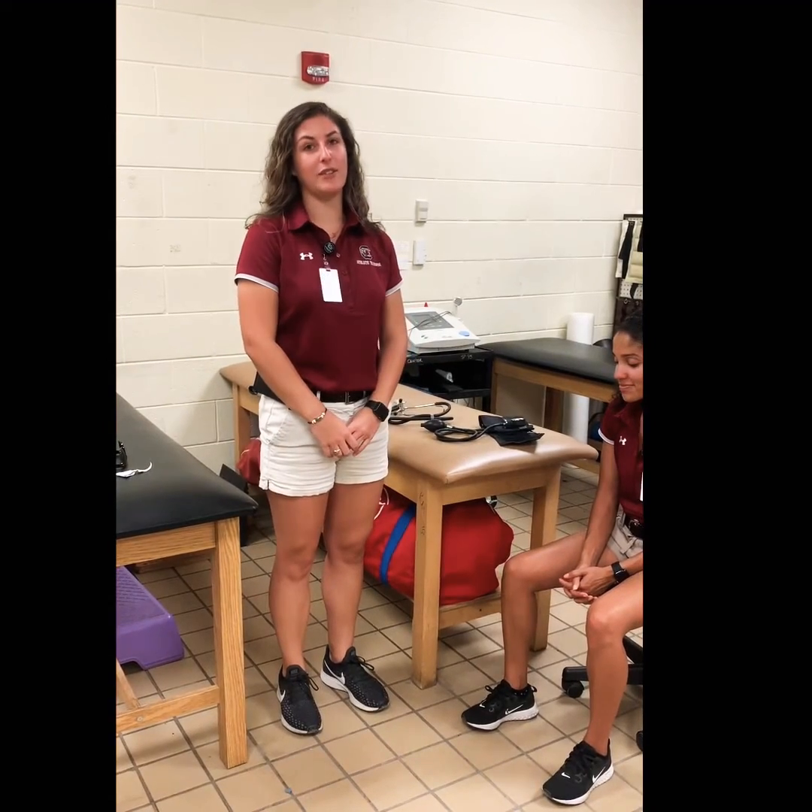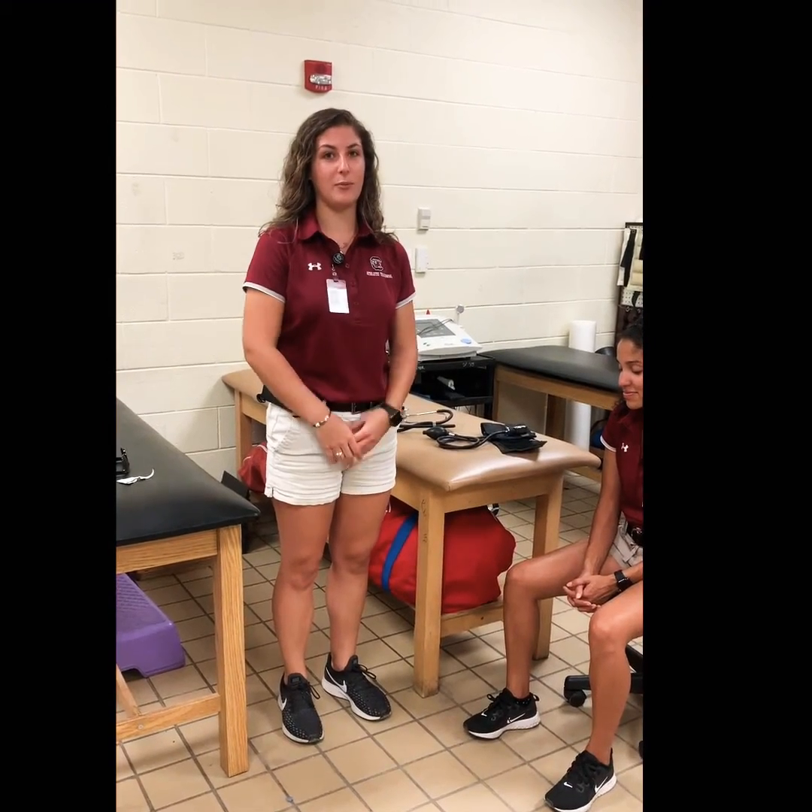My name is Nicole Faschner and I'm a professional athletic training student at the University of South Carolina. Today we will be doing blood pressure.